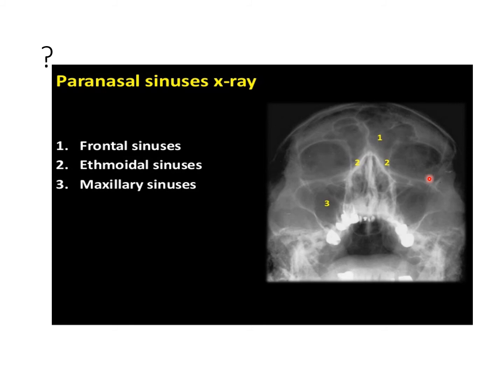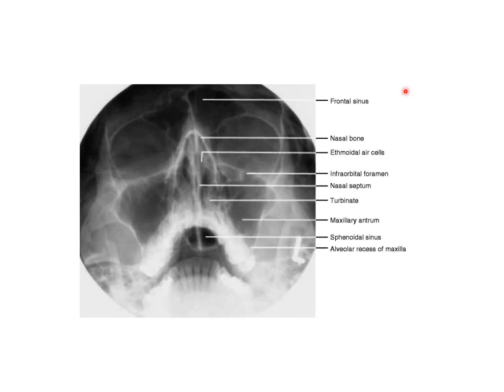This is Waters view, the occipito-mental view. Here you can clearly see the frontal sinus, the ethmoidal air sinus, and the maxillary air sinus. Also the bony orbit, the nasal septum and nasal cavity. In another Waters view you can again see the frontal sinus, ethmoidal air sinus, nasal bone, nasal septum, maxillary sinus, and the sphenoidal air sinus.